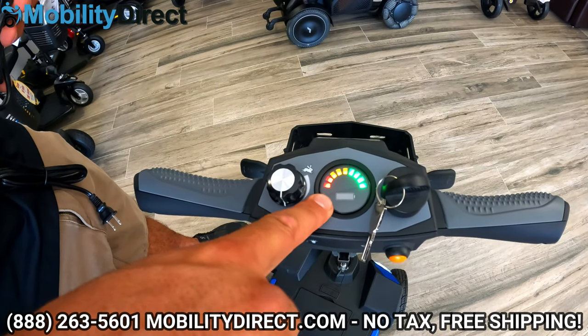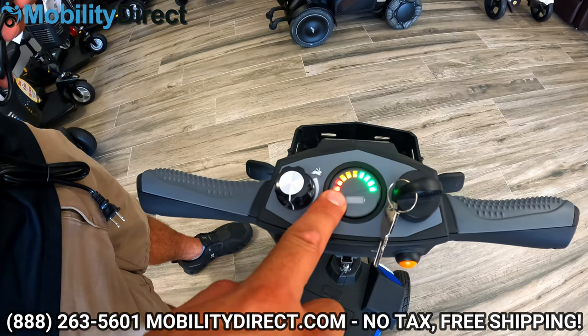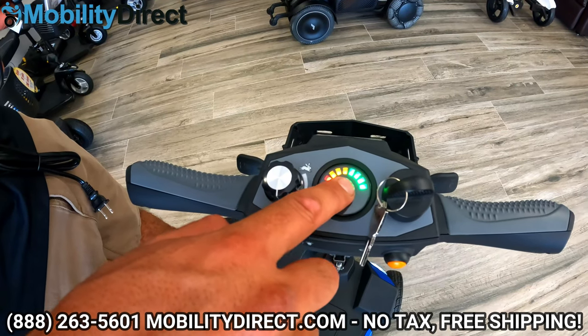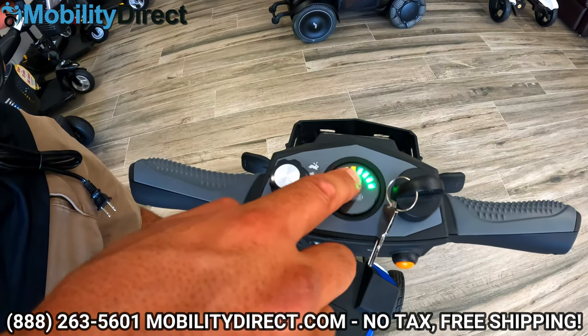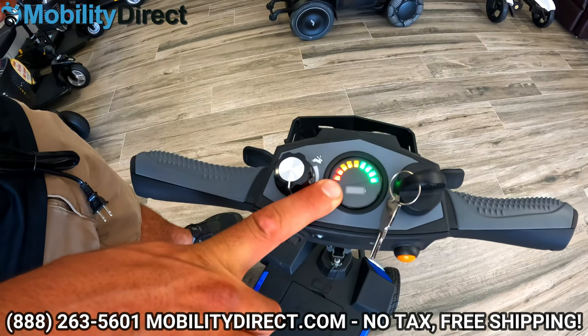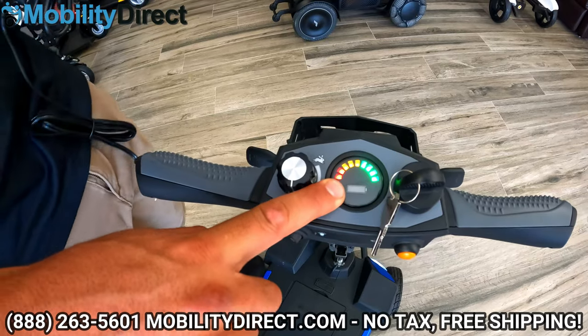We just turned the lights off for a sec so you can see the illuminated bars for the battery meter. Obviously it's fully charged right now. As you start to use your scooter, the green lights will disappear one at a time, then the yellow, and you want to avoid letting it get to the red. You can get up to 18 miles with the full-size battery that it comes with.